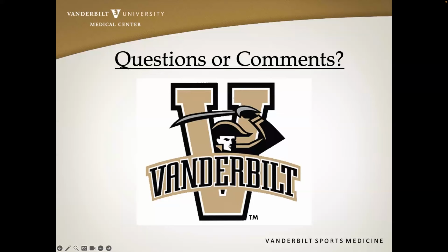And so if I'm doing a lateral or medial knee protocol or even a posterior, I'm always starting with those anterior images, kind of highlighting what Stephen just said about looking for fluid in the knee joint, because that's going to make me think differently about the differential diagnosis. When I am looking for fluid, you did show that you flexed the knee, and I just want to highlight that if you don't see fluid with this slight flexion, then I go ahead and actually flex the knee a little further, and sometimes I'm able to push fluid up into the suprapatellar recess.